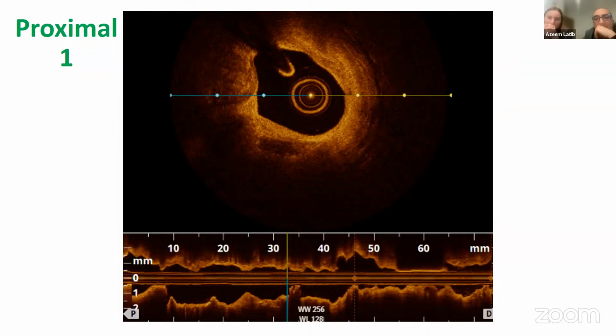Right. The problem with nodules is they're just so dense that whether it's with IVUS or with OCT, you really can't interrogate what happens beneath it, which makes it very difficult to anticipate which modification tool is going to actually work for you. What I've been doing is using exactly what you just said, a combination.